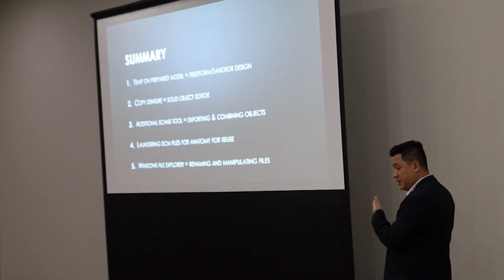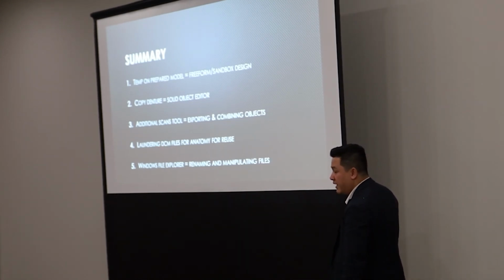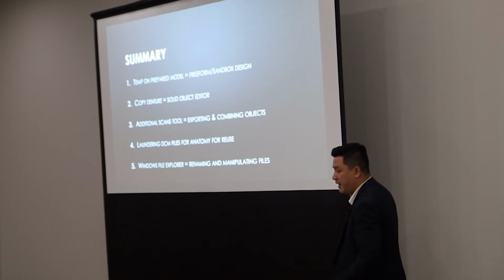But if you are interested, like I said, dentaltechtips@gmail.com, send me an email. I'll add you to my mailing list when we confirm the date for that hands-on course, and we'll show you how to do that one. And then, of course, Windows Explorer, renaming files, anatomy for use, modifying scans, changing things around so that the software lets you do what you want to do with it.